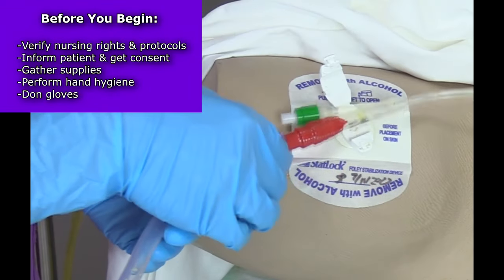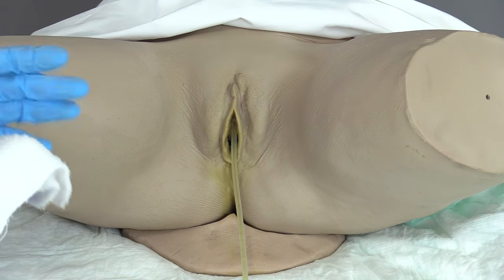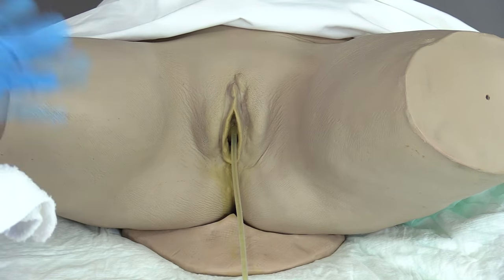First, I'll remove the catheter from its securement device. Now, some guidelines may suggest doing cath care before perineal care, while others may suggest doing the opposite. Therefore, you always want to check your facility's protocol for the proper sequence. For this demonstration, I'll perform Peri-Care first.